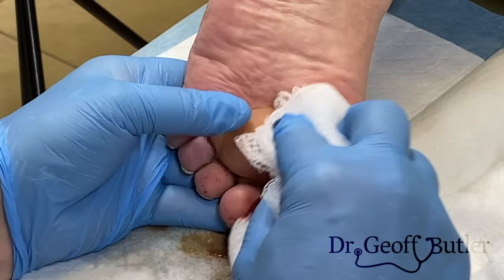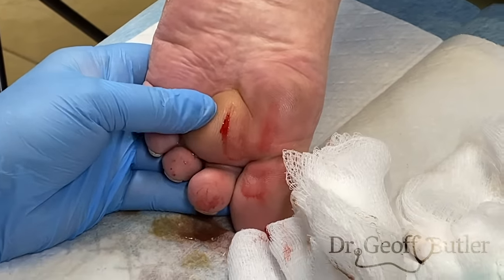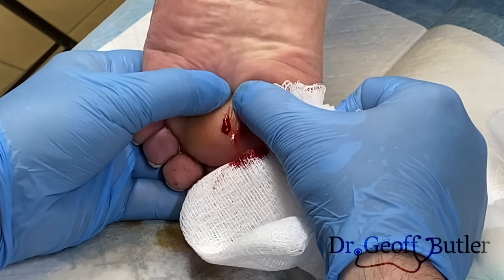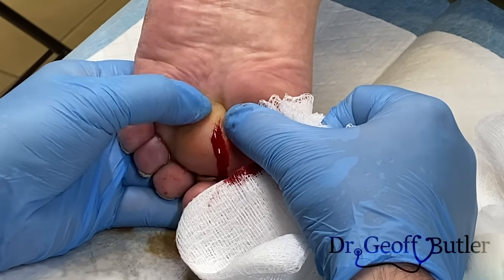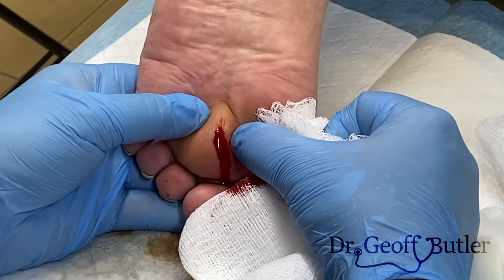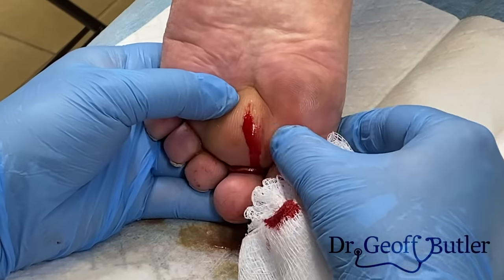Do we have a curette here? When I push on this side, does it hurt much? No, not too bad. How about around here? A little bit.